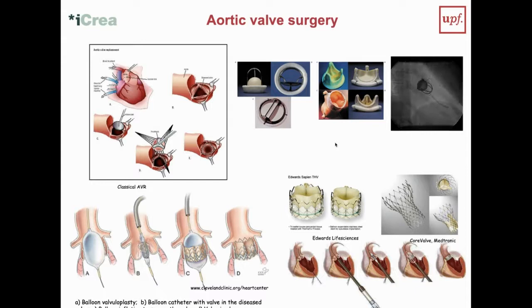What they're starting to do now, it's not a solution for both things, but it's to make the operation more feasible and potentially in the future have more easy ways to do redos, is that they actually start with what we call transcutaneous valves. Transcutaneous means that you go trans the cutanea, which is the skin. So from the outside, you can actually do a valve implantation without having to open the chest fully.